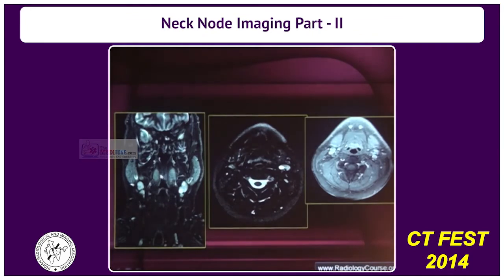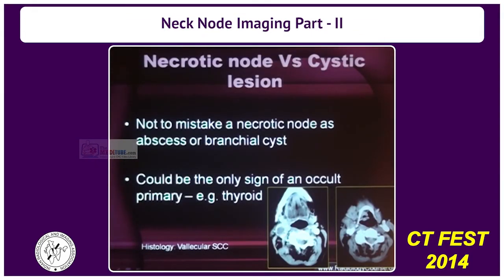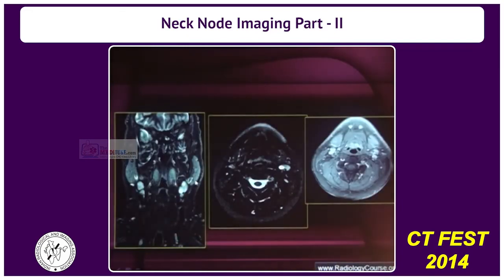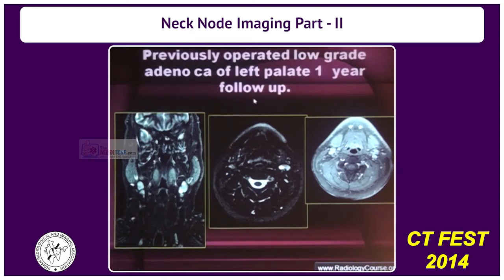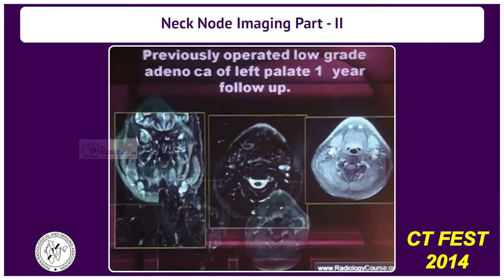Here is a patient who has a cystic node — this is a necrotic node and the patient has a valicular carcinoma. Another necrotic node in a patient previously operated for adenocarcinoma of the left palate, which on final histology turned out to be adenoid cystic carcinoma. You can see the cystic changes in this level 2 node.